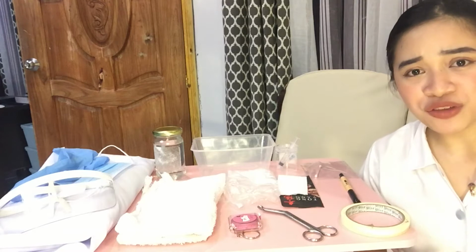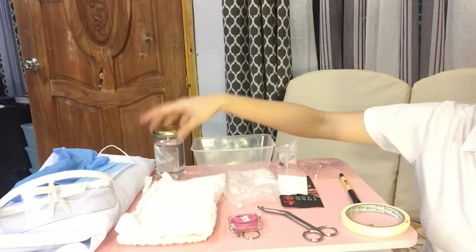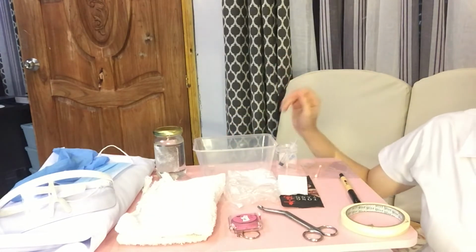Step 4. Gathers appropriate supplies. Preparation promotes efficient time management and an organized approach to the task. So we have to gather the necessary equipment. So we have here the normal saline solution, the kidney basin, but if you don't have any kidney basin, you can use a plastic container.